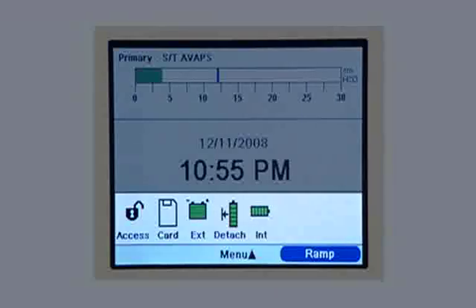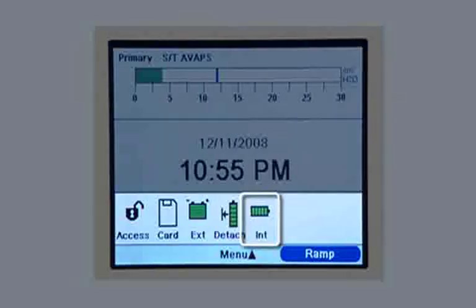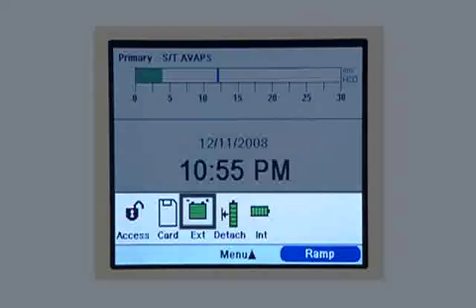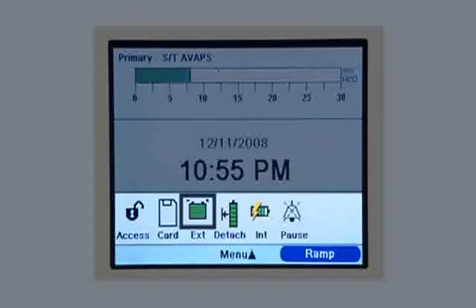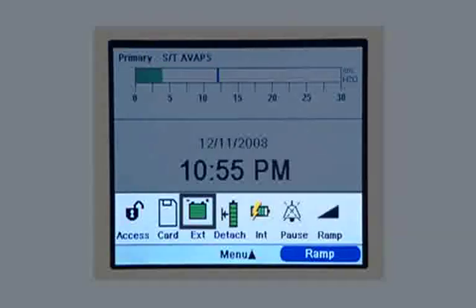The internal battery is indicated by a horizontal symbol. You can tell it is fully charged because the symbol is completely green. A black box appears around the battery which is currently supplying power to the ventilator. A lightning bolt over the detachable or internal battery symbol means the battery is being charged. A bell icon with an X drawn through it indicates that the pause button has been pressed and the audio pause is active. The ramp symbol appears when the ramp feature is in use.